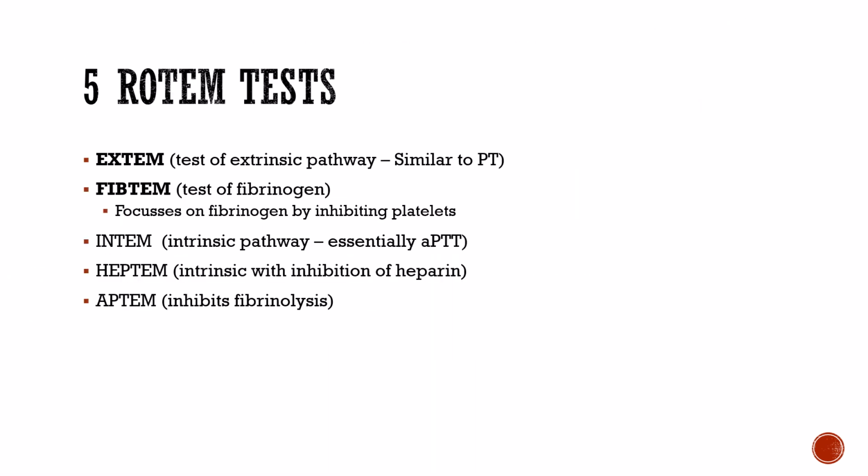So coming on to ROTEM tests. The only 2 that I'm probably going to be covering are EXTEM and FIBTEM. And that's because they're the ones that are in most of the MTP protocols, and the ones that seemingly most commonly come up in the exam. The INTEM, the HEPTEM, and the APTEM are basically for special circumstances and when patients are on heparin. We're just going to be focused on EXTEM and FIBTEM for this.